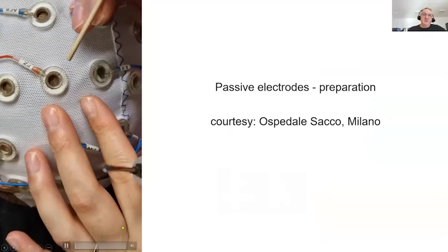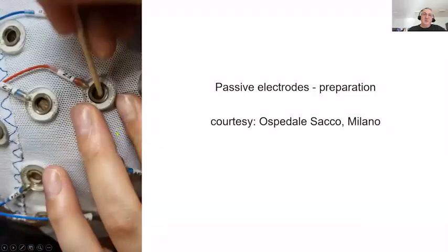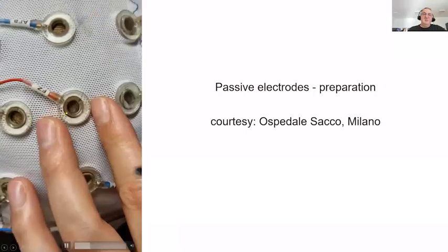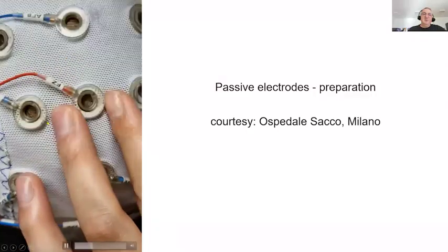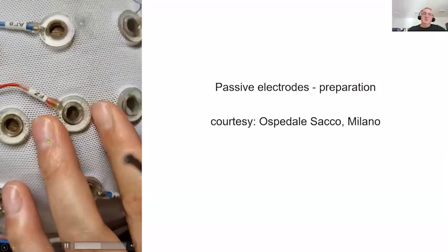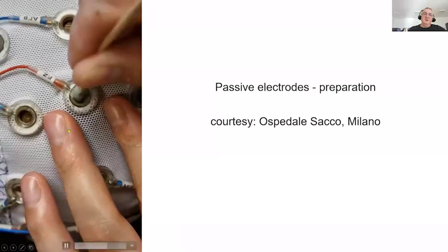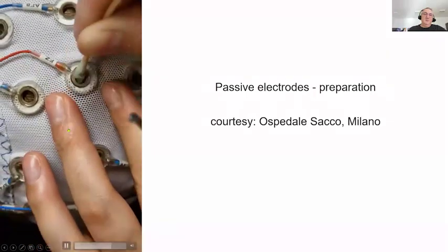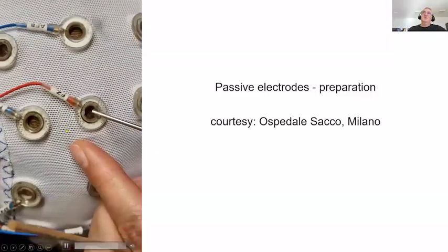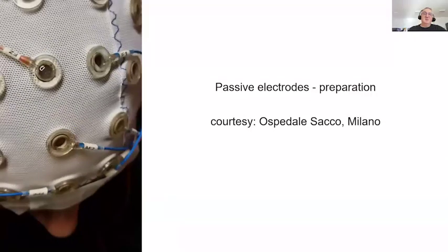And here is a very short illustrative video. How do you do that? So for the passive electrodes, first of all, you should move away the hair laces so you can see the scalp. And you see she's now using the cotton with that abrasive agent, and you firmly clean the scalp. So the sensation is like you would actually pick up a bit of sand and rub it against the skin.